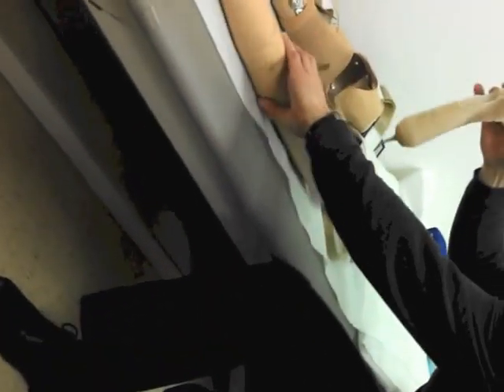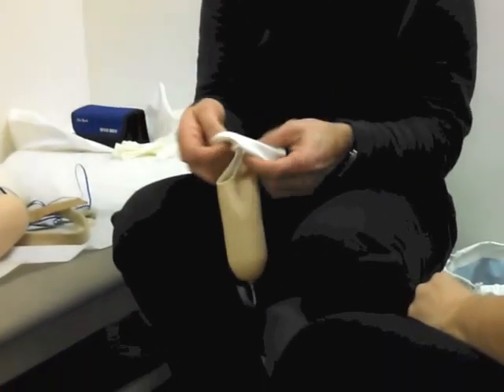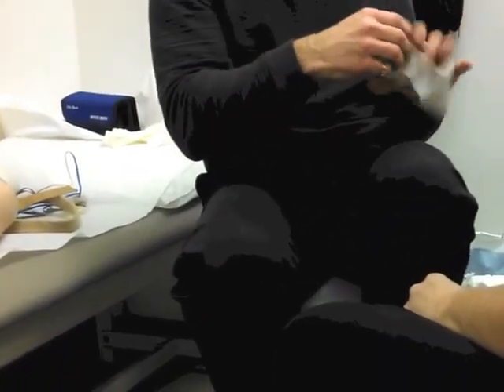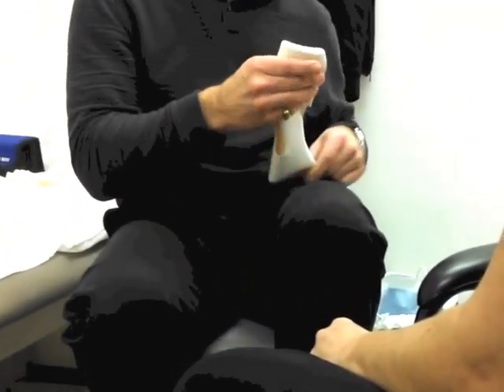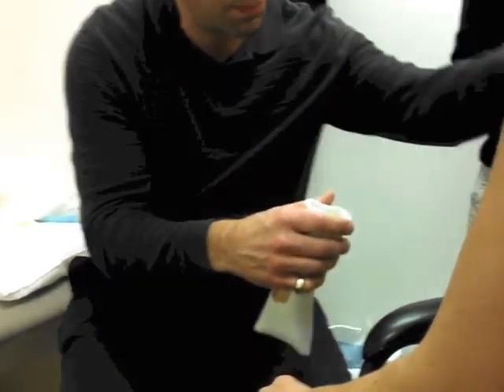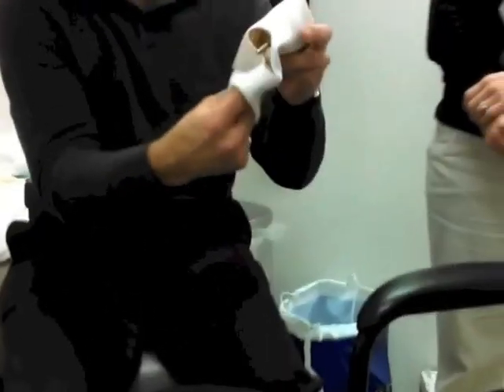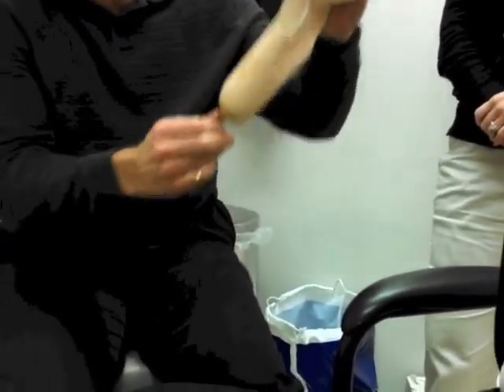This is one of the ways of suspending a prosthesis. What happens is you would just reflect this back on itself — this wouldn't be your size, but I have to measure the distal end of your limb. Basically, we're going to roll this up onto your limb. It would come up and over your shoulder, come up into the armpit, and this would hold on and actually suspend on you, just kind of locking on the silicone, holding onto your arm.